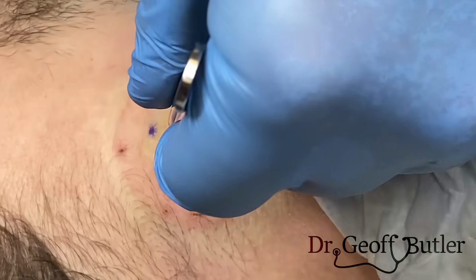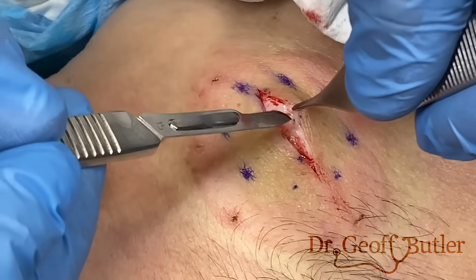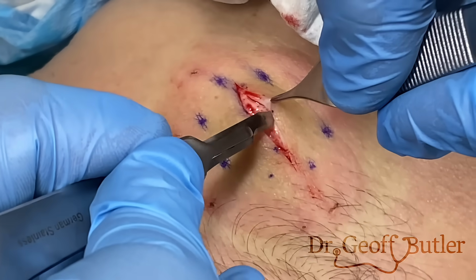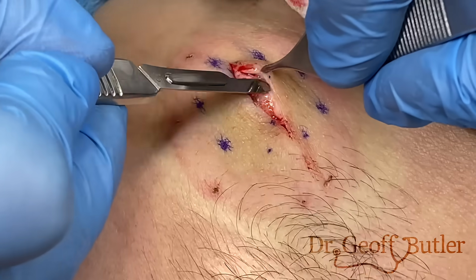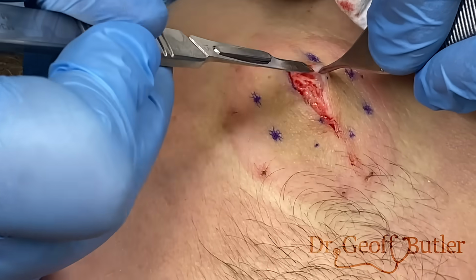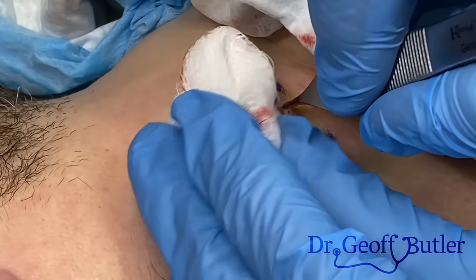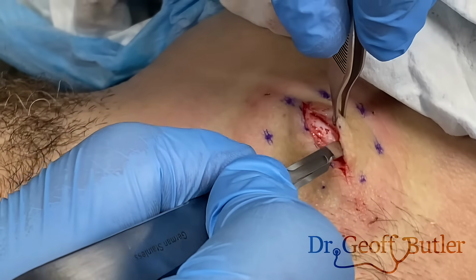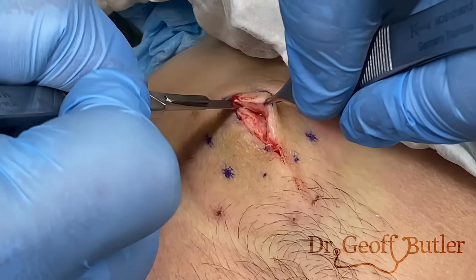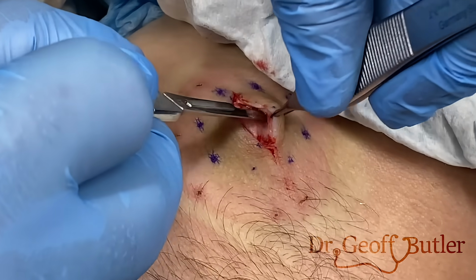You okay? Yep. So this is the side that's more challenging for me to deal with. So you can tell the shoulder's sort of in the way there. Not impossible by any means, but this is where the combination of the angle becomes a bit more difficult and the elasticity of the tissue makes it a little bit more difficult. Just add that for me. And you're still comfortable? Yep.